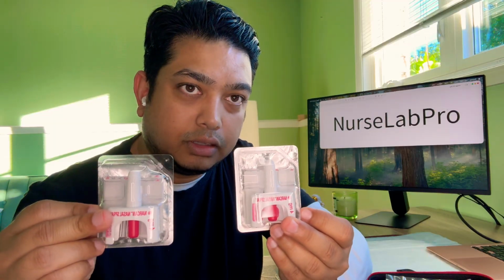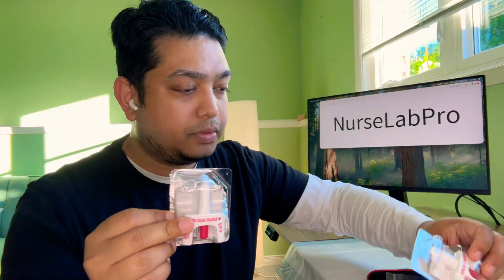When you find a patient like this, it is an emergency. You will have kits like this to use. I feel like we have all seen this kit, but we have not opened it because we have never come across a situation where we have to use it. So I'm opening this for you just to show you how it looks. You will get 2 naloxone kits in this, each of which is 4 milligrams.